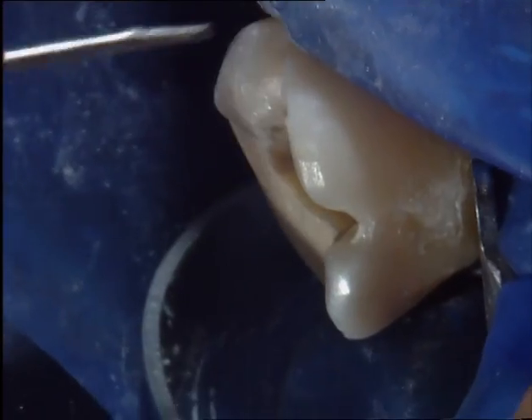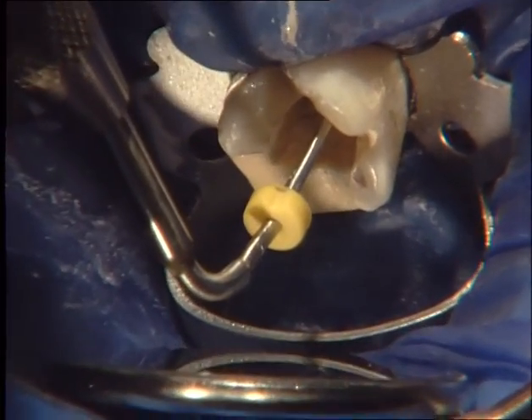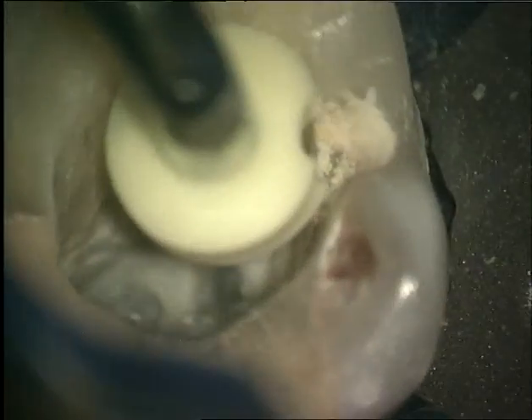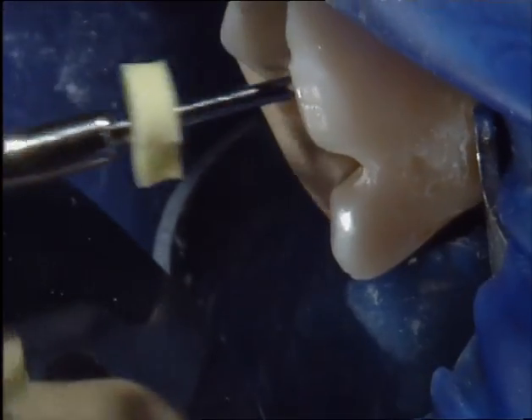After melting of the cone with the tip of the Buchanan plugger in the pulp cavity area, the activated plugger is driven through the gutta-percha in a single motion to a point about 3 millimeters shy of its apical binding point. While maintaining apical pressure on the plugger, the button is released, and the plugger slows its apical movement as the plugger tip cools. After the plugger stops, about 1 millimeter from its binding point, apical pressure is sustained until the apical mass sets, about 10 seconds, taking up any shrinkage that occurs upon cooling.